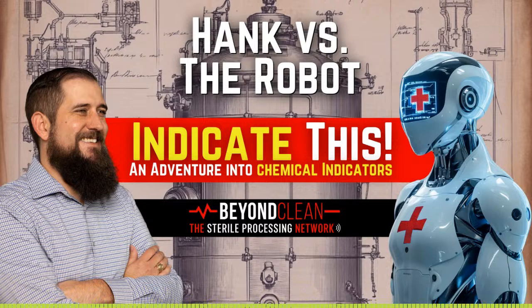Chemical indicators and integrators are like the sentinels. They keep an eye on things at a glance and sound the alarm when something's off. But when it comes to saying, yes, this is absolutely sterile, biological indicators are still the heavyweight champions. So while each piece has its role, it's their synergy that ensures we're doing what we promise to do every day in SPD, protecting patients with every single tray.